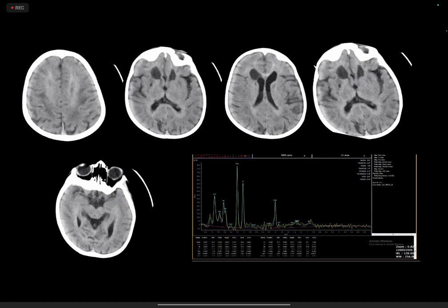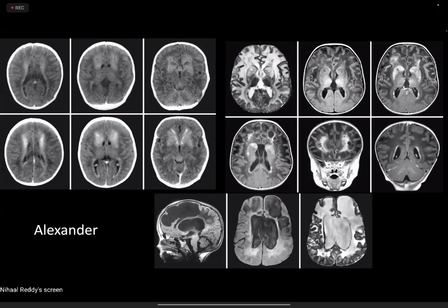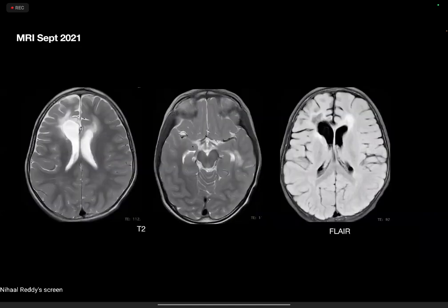And the reason for doing the CT was to look for calcification, because initially we thought it was LCC, as it was labeled hypomyelinating initially. That's right, you still admit for calcification. But the only thing is the CT periventricular rim was slightly different. Sure. Thank you.